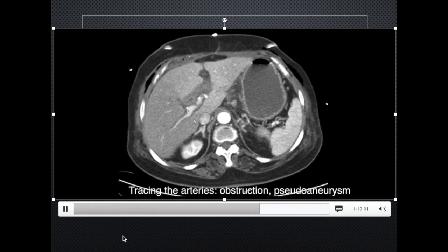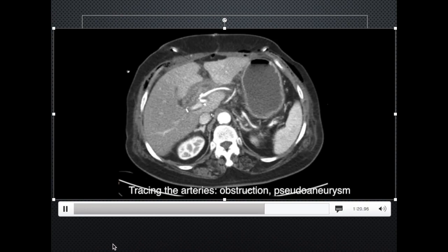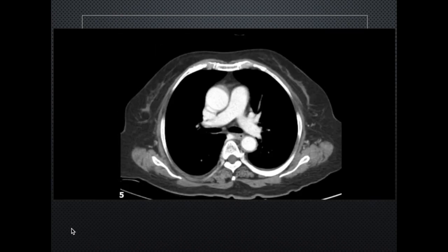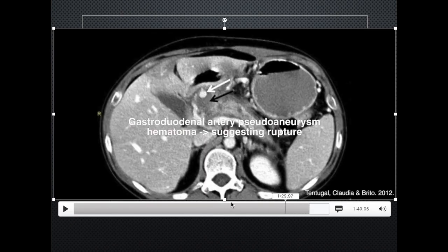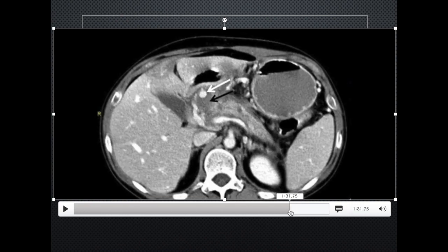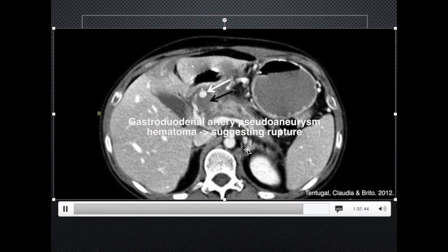After the veins are checked, the arteries are also traced. They are checked for any pseudoaneurysms, especially in the gastroduodenal artery, and for any obstructions. This patient is alright, but here are some examples of gastroduodenal artery pseudoaneurysms. This is the pseudoaneurysm, and there is hematoma nearby, suggesting rupture of the aneurysm.